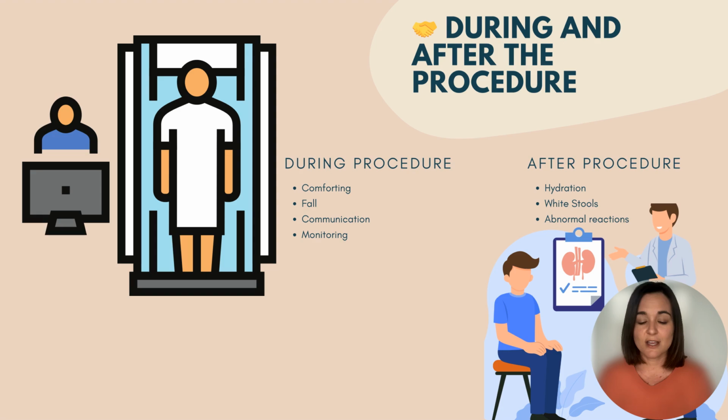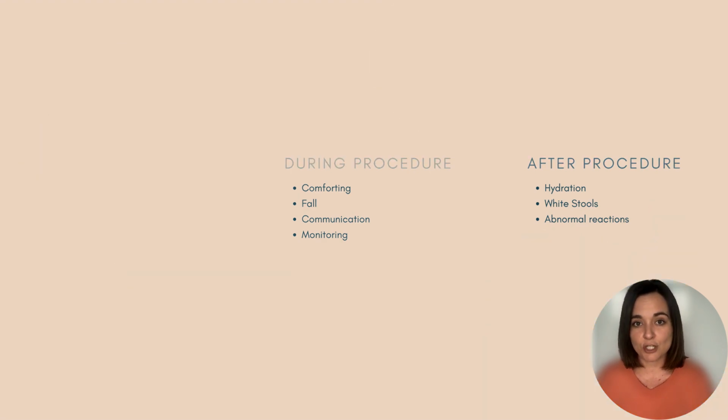Post-procedure instructions. Hydration is key, especially if contrast media was hyperosmolar. Reinforce that white or pale stools are expected after the barium. Let them know to contact their physician if they experience pain, vomiting, or difficulty passing stool for more than 24 to 48 hours. If a reaction occurred, document it and provide follow-up instructions.